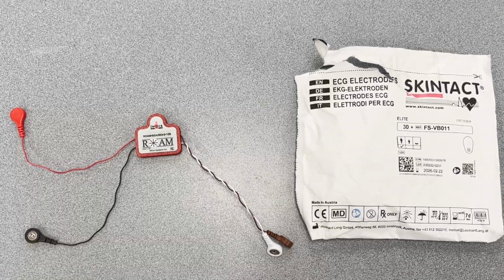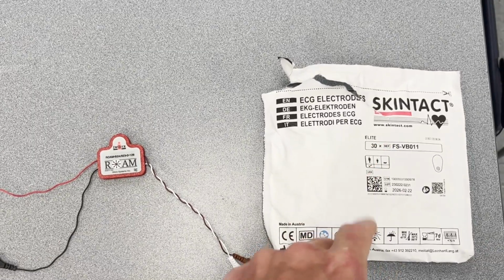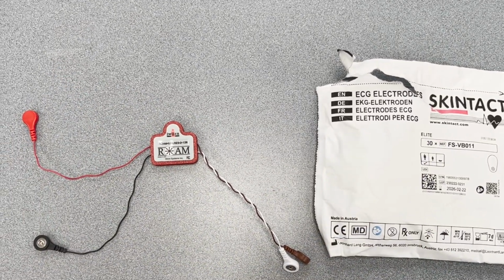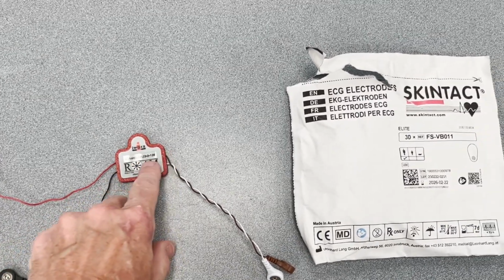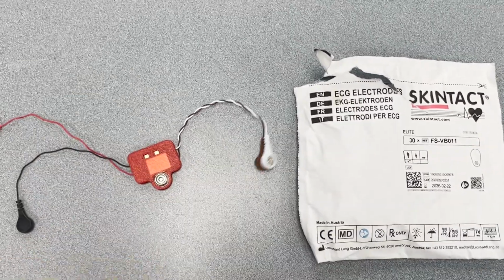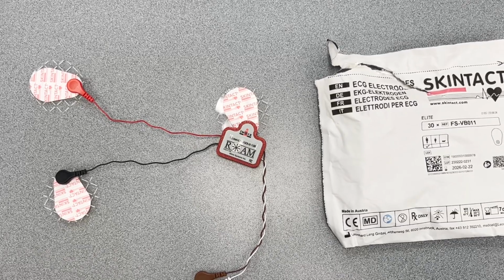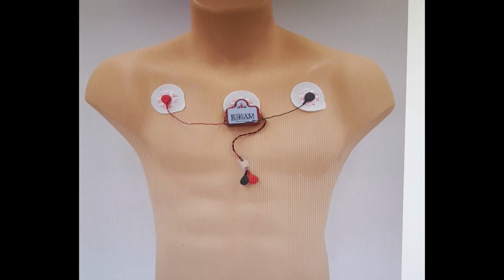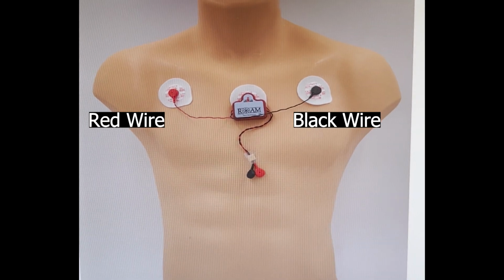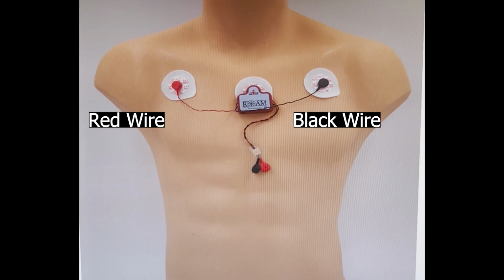For this test, we will utilize the skin tack electrodes, and we will be attaching them to the red, black, and the back of our sensor device. When these electrodes are secured, they will now be placed on the subject. Configuration of the electrodes will be as shown in this image.